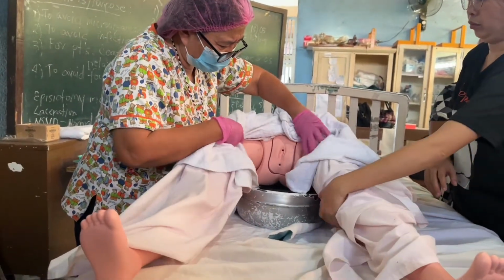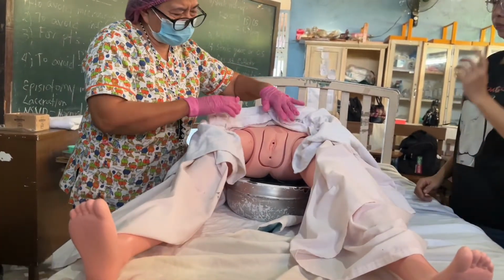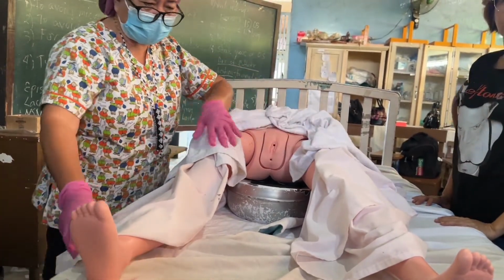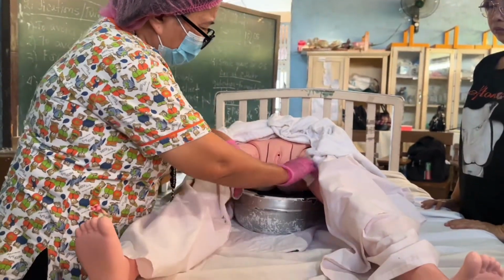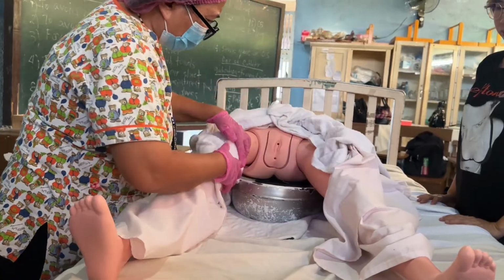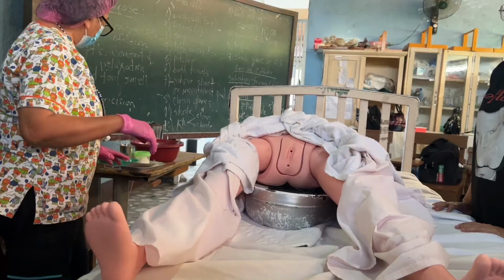Practice na lang, dito. Pwede naman. Yan. So, expose ninyo ang area to be cleaned. Dapat expose. Tapos na siya ay incontinent pad. Present incontinent pad.